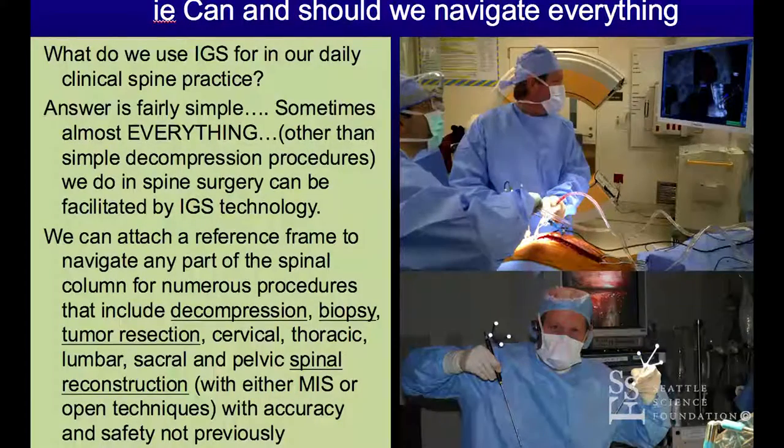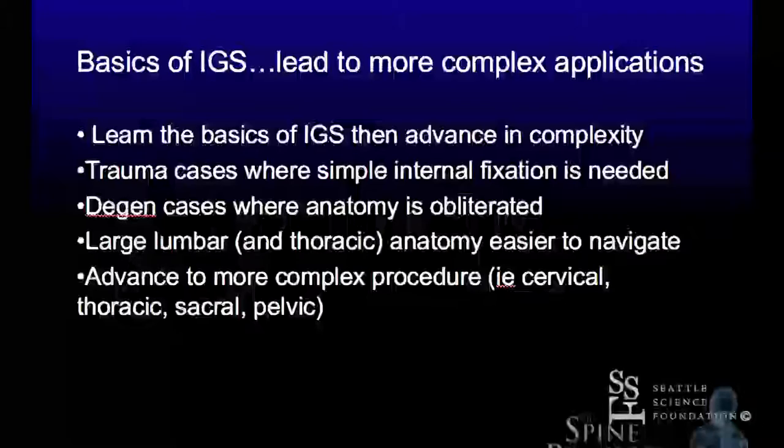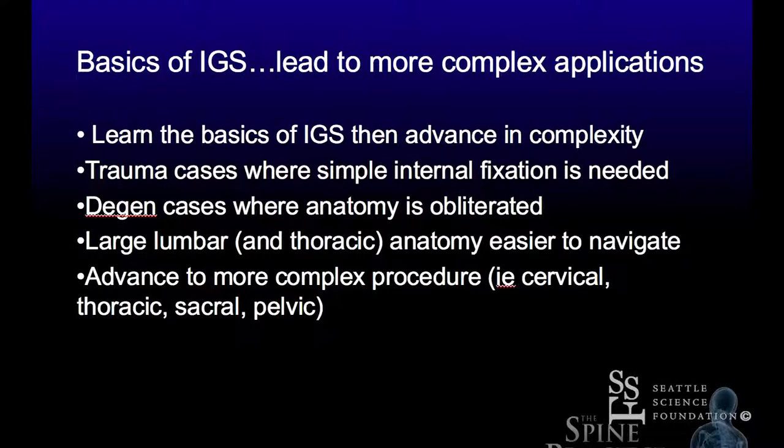Can and should we navigate everything? I think potentially we will. There's going to be technology that lets us do laminectomies and microdiscectomies in ways that we haven't even dreamed up yet. Some of these things are beyond us, maybe beyond our lifetime. Learn the basics of IGS and then advance in complexity. As I said, do trauma cases, do some degen cases.